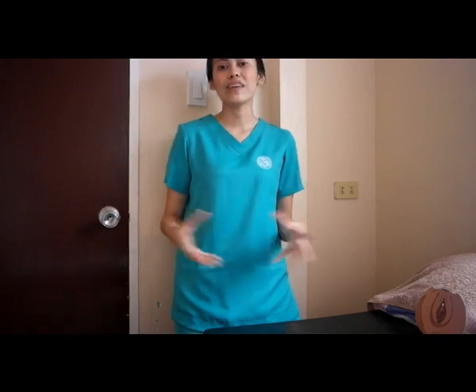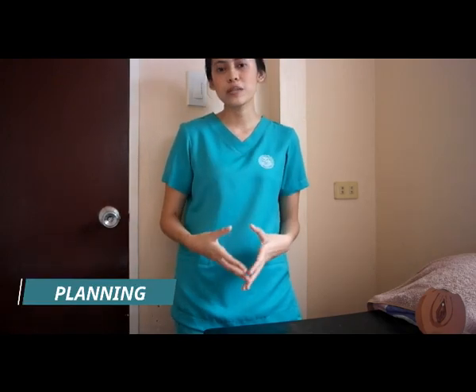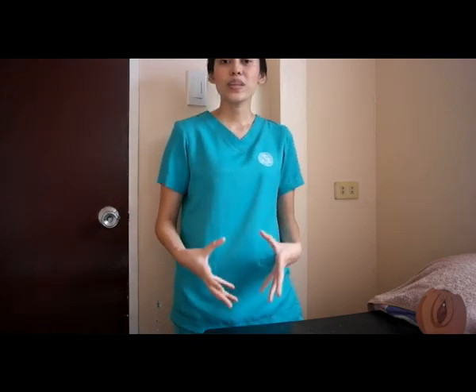The next we have is the planning. So it is our responsibility to always verify the physician's order before any conductive procedure. Then we prepare the client and the materials for this procedure.